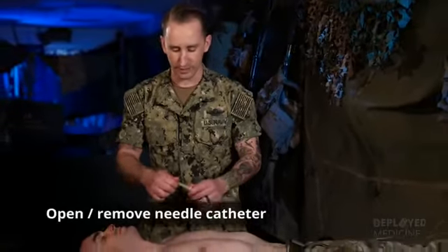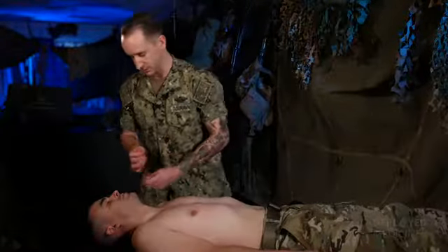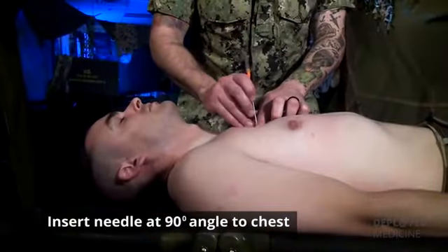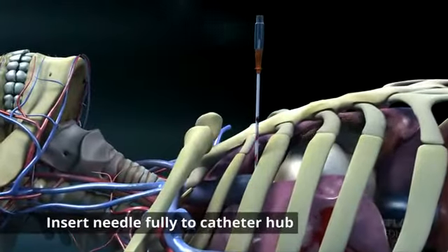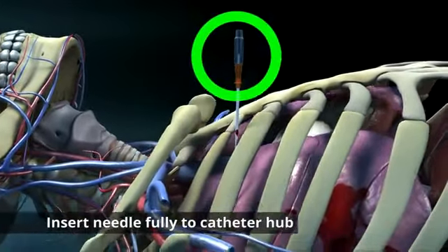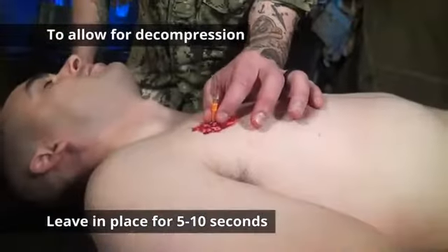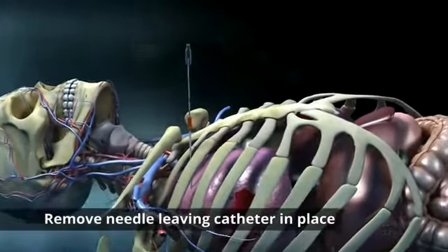Once I've identified my site, I'm going to remove the needle catheter. Remember, it's 14 or 10 gauge, 3 1/4 inch. I have my site identified, and I'm just going to insert this at a 90-degree angle perpendicular to the patient's chest. Insert the needle and catheter fully to the catheter hub and leave in place for 5 to 10 seconds to allow complete decompression to occur. After the decompression has been performed, remove the needle, leaving the catheter in place.